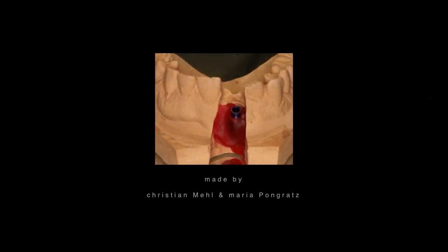The implant position is transferred to the model. The implant analog is fixed with pattern resin in this case, and a PEEK abutment is placed onto the implant analog, and this splint is used to shorten the temporary abutment. Then we just use temporary crown material to produce a temporary. This is the final temporary before glazing.